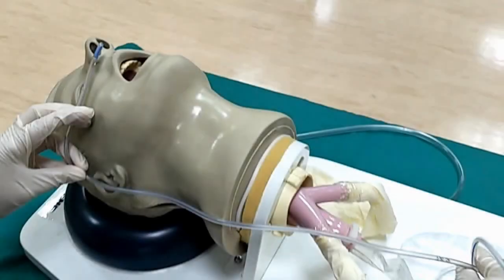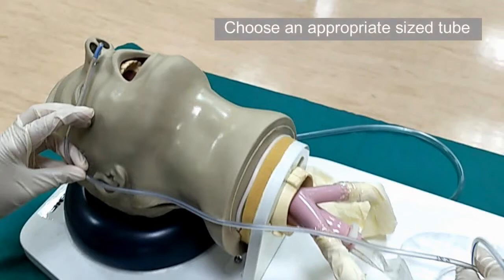Before you begin, please ensure that your hands are clean and gloved. Obtain an appropriately sized nasogastric tube — please refer to your reading materials for more information on this. The patient should be positioned with the neck straight, either in supine or sitting position.